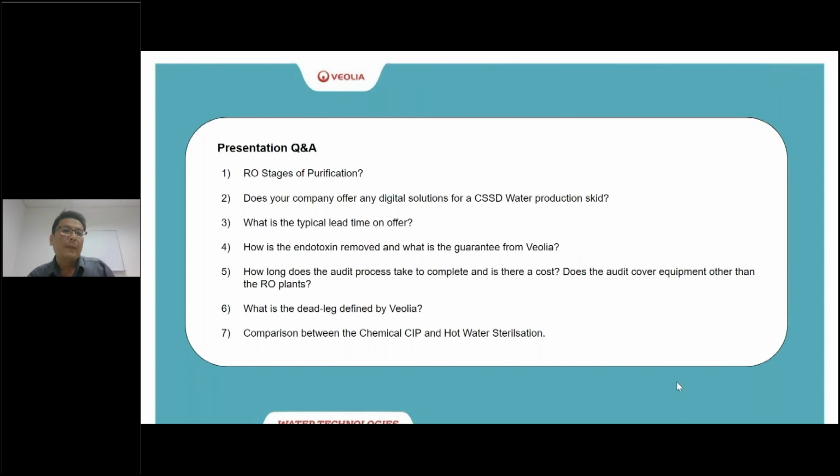Some of you may ask, how often is enough? To me, it depends on the procedures and the continuous monitoring of the system performance, to achieve the balance of the system downtime and the healthcare center operation requirement. And a final reminder: the infrequency of cleaning also leads to the inefficacy of the biofilm control result. So you could engage us further for details. I hope I answered question 7 well enough.